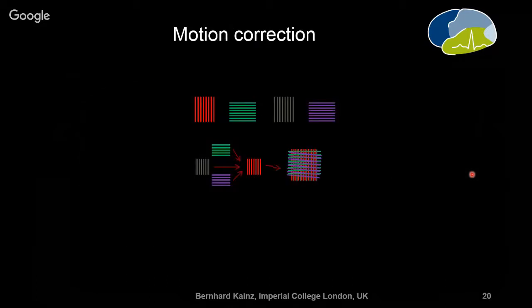So let's say we now have a few of these stacks. These stacks of slices usually consist of parallel slices and motion corrupted data. We have, let's say, 4 orthogonal stacks here, and what we actually try to achieve is to realign all of the slices with respect to one of these slices as a template. Ideally, we try to calculate and optimize the motion out by having a heavily oversampled input space.